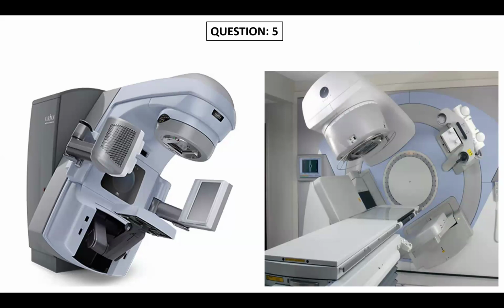Sir, CBCT, which we are taking, either we can go with the kV CBCT or the MV CBCT, sir. For daily imaging and proper matching, normally in the machine, as of my knowledge, with Varian and Elekta we don't have any MV CBCT. With MV, we have 2D imaging. So it's only 2D imaging. With only the kV source, we can do CBCT, like a 3D cone beam CT.